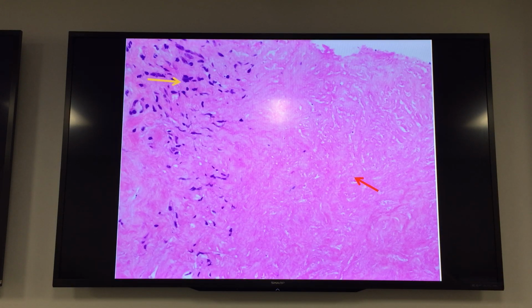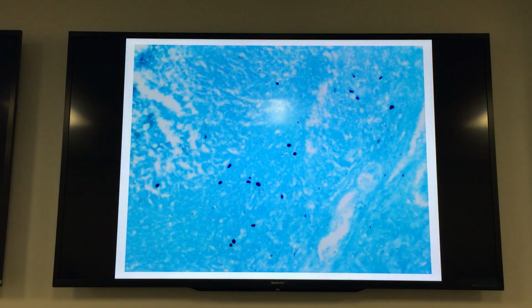So what does that make this? Necrotizing granuloma. And what do you see inside it? Yeast forms, right? This one is histoplasma, which is what you will see the most often here. Almost like you saw TB in India, you'll see here histoplasmosis. It's like the endemic baseline infection for this place. It's very common to see that on core needle biopsies in places that have a high histo.